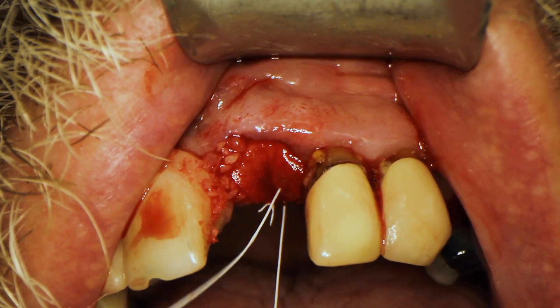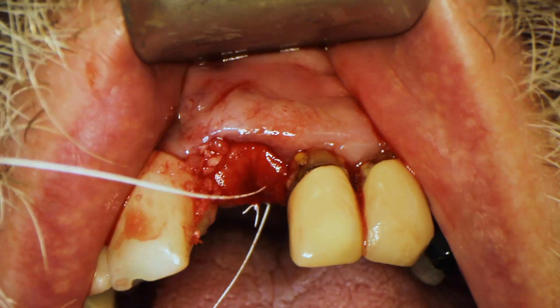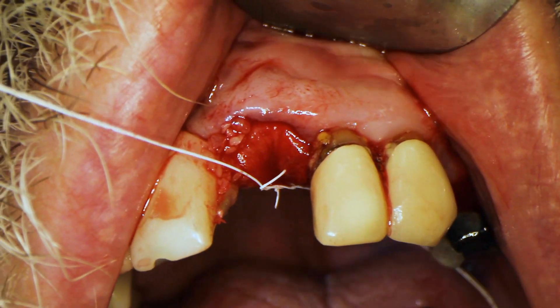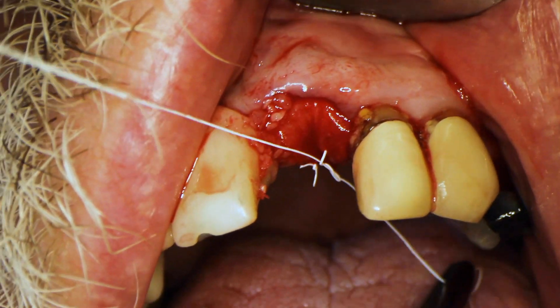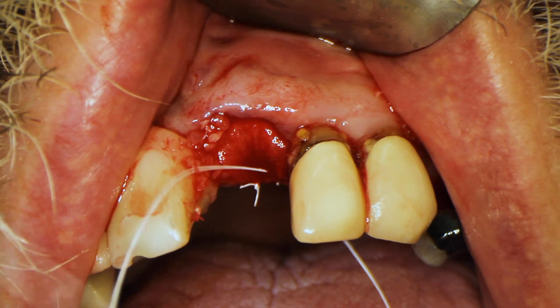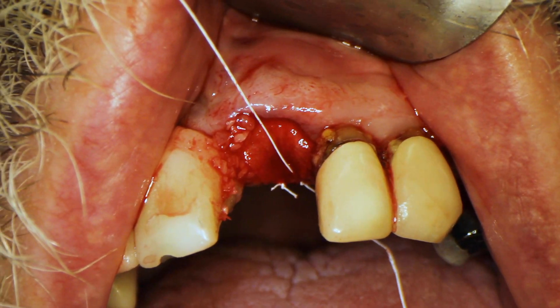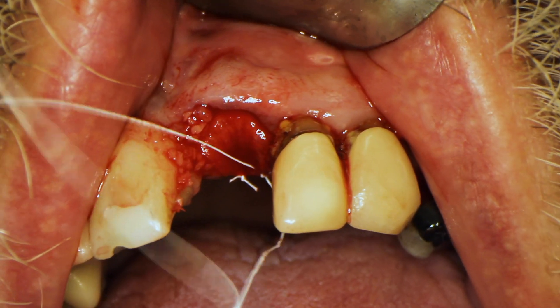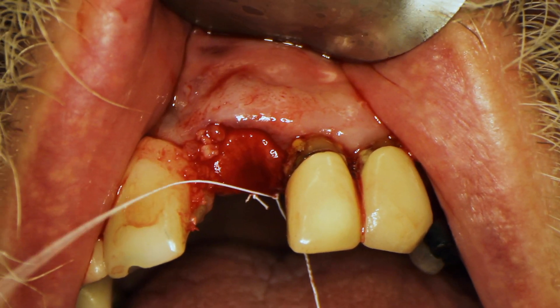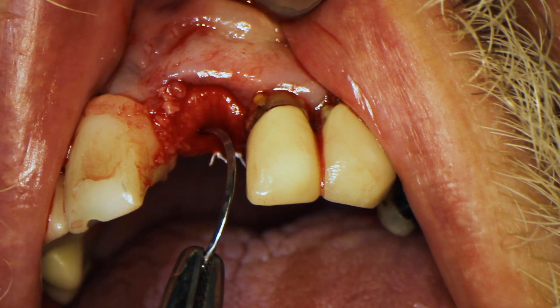The use of a membrane is somewhat controversial — a lot of people ask if you do a socket graft whether you have to use a membrane, or if you use a membrane whether you have to use graft. There are studies pointing one way or another, but if it doesn't hurt and it makes me feel better about the graft being contained, and this technique is pretty predictable for me, then I'll go ahead and do it this way. I feel like I'm getting a better outcome, especially in cases where I'm not getting primary stability.